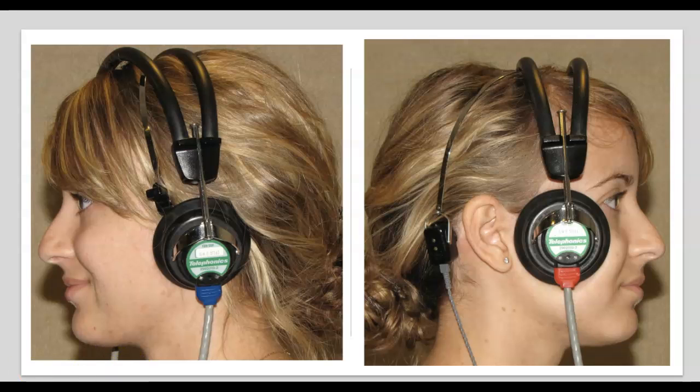Okay, so this is the right ear, and you have the bone conduction oscillator behind the right ear. Notice that we're not masking the right ear because we're testing the right ear. All right. And then on this side, if you flip it over, we're putting masking noise in the left ear. Okay, so in this case, we are testing a right masked bone conduction.